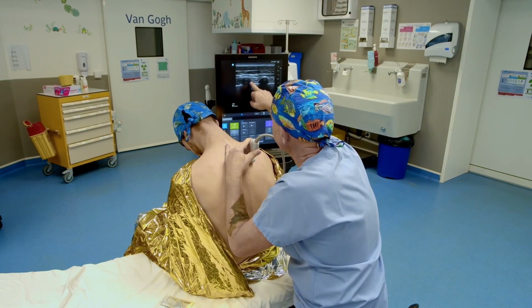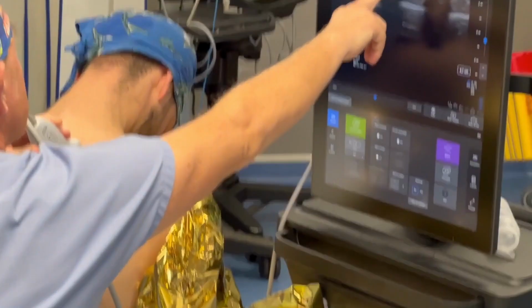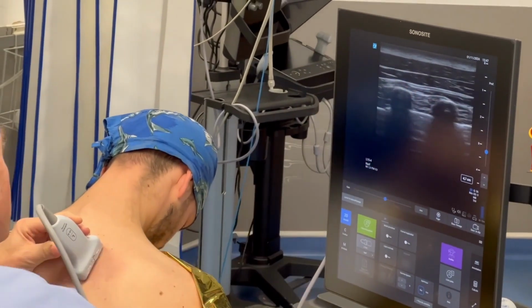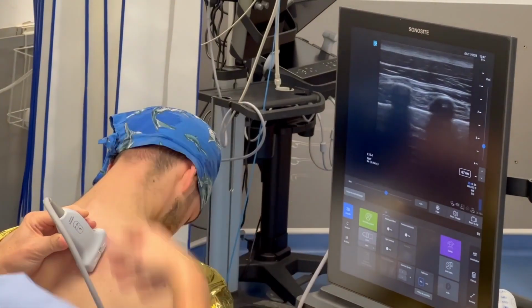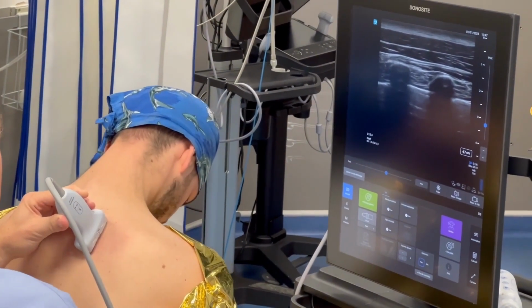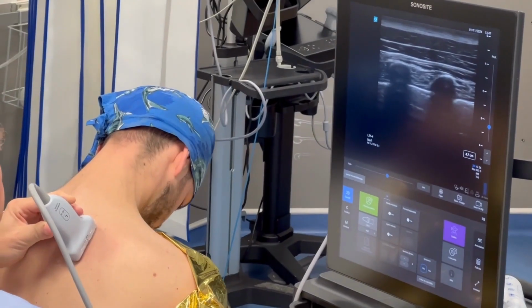This is the paravertebral block. At this level, it's the mid block. And here you have an erector spinae block in contact with the apophysis. So this is really the most effective. But sometimes it's a slightly tricky block, a bit deeper. We're getting close to structures, but it covers the entire surgery.